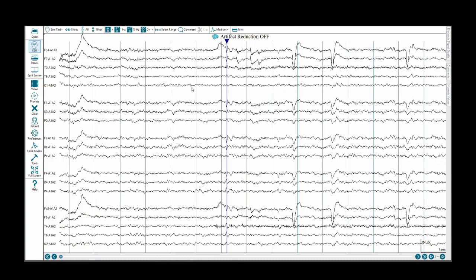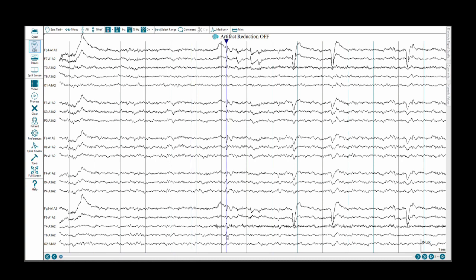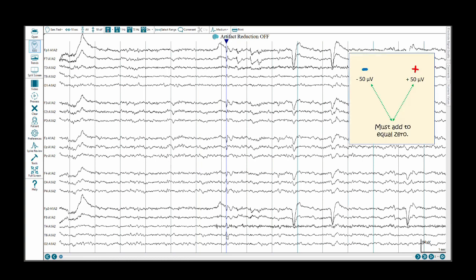We have switched to a referential montage, it is an ears tied montage, that is A1 plus A2 divided by 2. That just dilutes the effect of A1 and A2. If we look at this particular discharge, we are going to accept the premise that most brainwave discharges as recorded with scalp EEG are going to be negative. They are going to have a negative charge. That does not mean that there is not a positive component associated with that particular discharge.